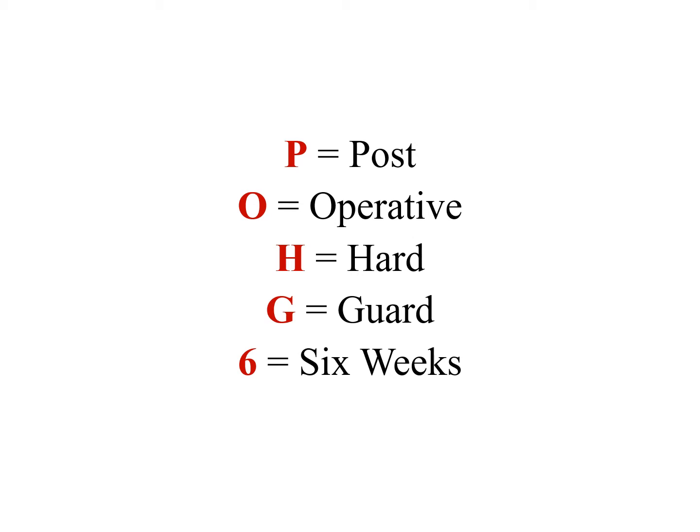Now we've got to do several things. We have to check several things. We want to make sure our progress is going well. 6 weeks is a big time, and it's mostly managed by the dental assistant, the TMD assistant, who should be you watching this video.